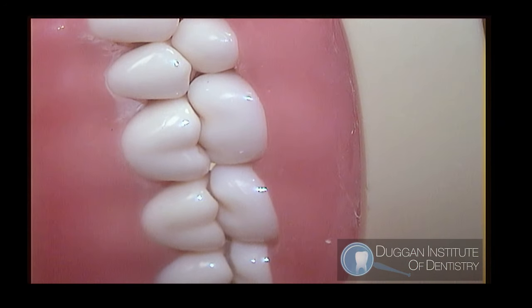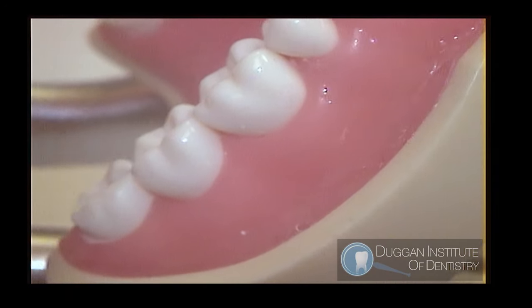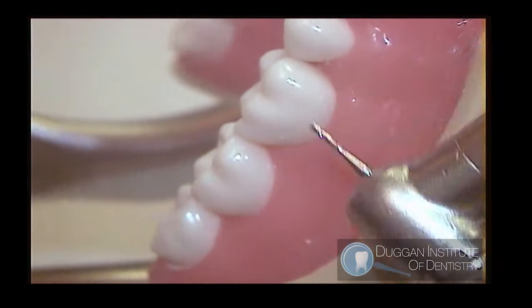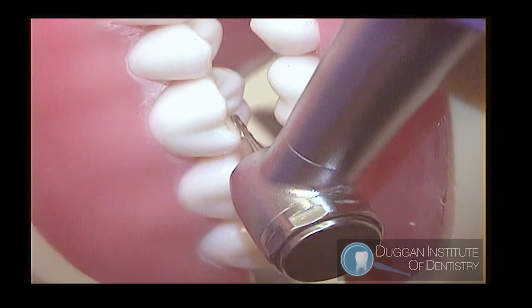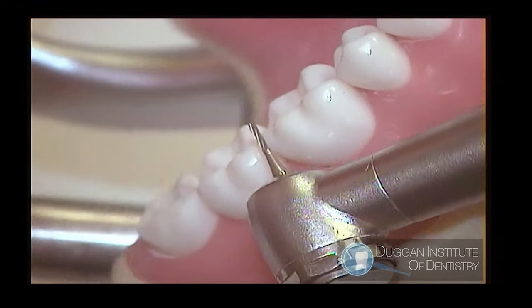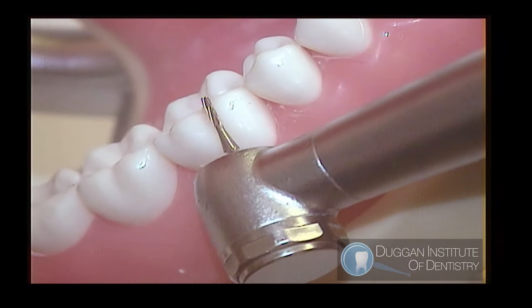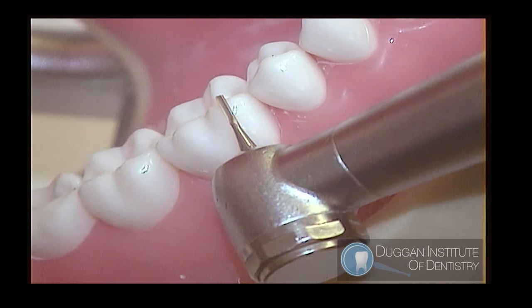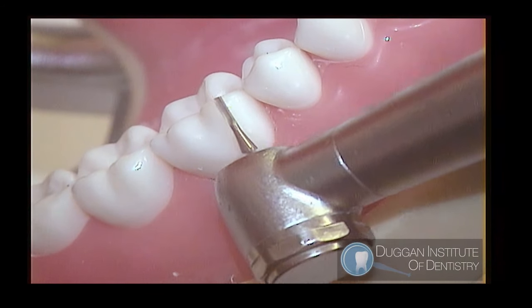Occlude the typodont to ensure that the maxillary cusps fit the mandibular grooves. Take the angle from the opposing cusp. Bring that angle down and begin to create a depth angle on the cusps and grooves. Use minimal pressure to reduce. Gently round cusps and grooves to the embrasures.